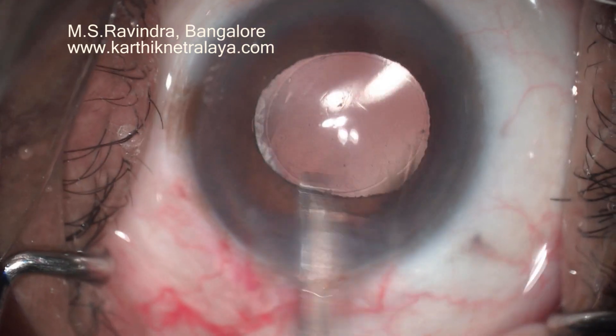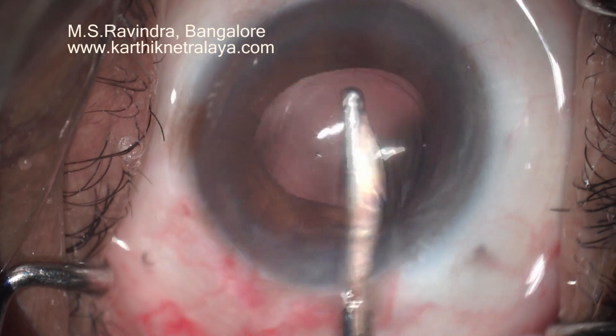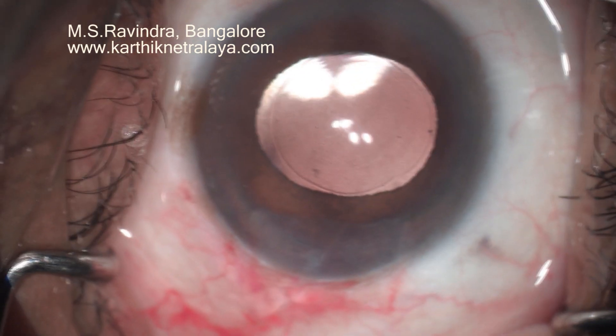The lens is implanted in the capsular bag, and the capsulorhexis is smaller than the diameter of the IOL optic. The viscoelastic in the entire eye is removed, especially from the capsular bag as well as the angle region, so that pressure does not increase post-operatively. That's the end of surgery.